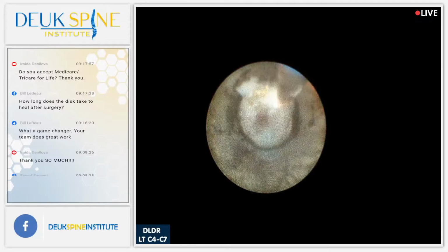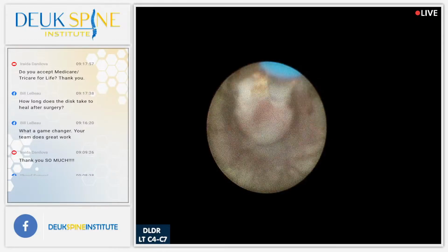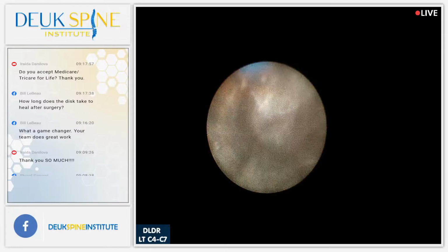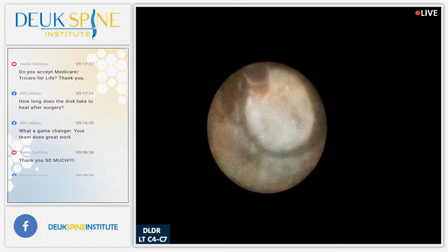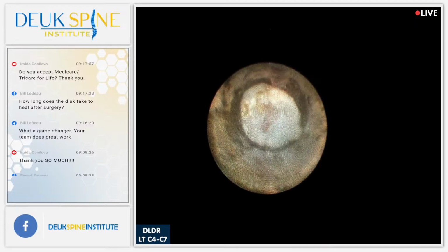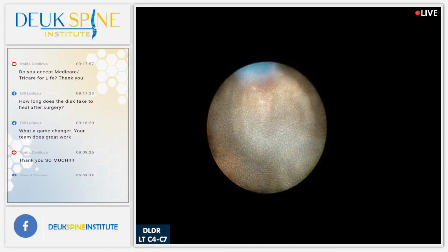All right, welcome back. You've seen what's happening in people's cervical spine with a herniated disc, why they have so much pain coming from the disc, and the reason is simple. Man, there's a lot of artifacts with the laser, a lot of bright lights flashing.